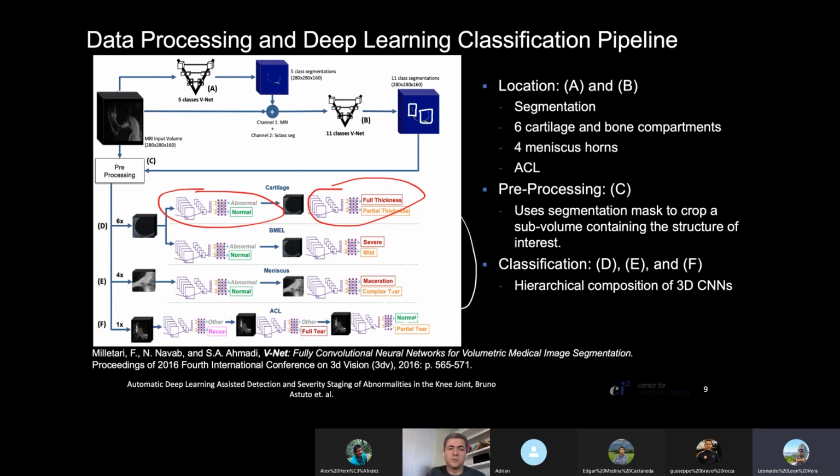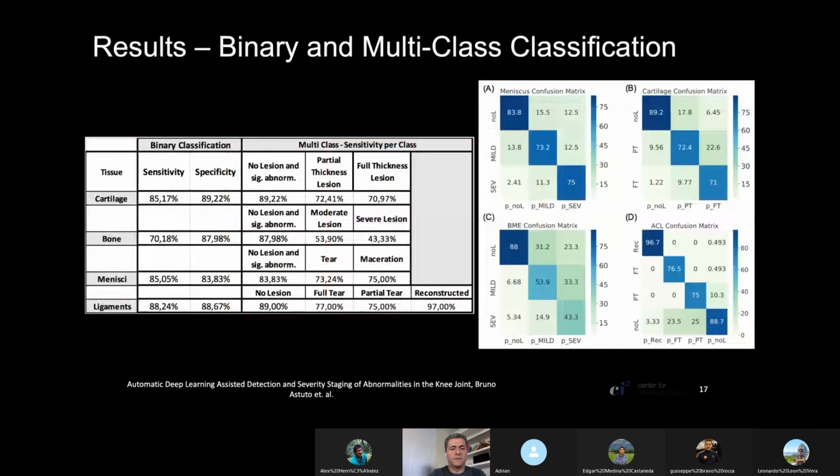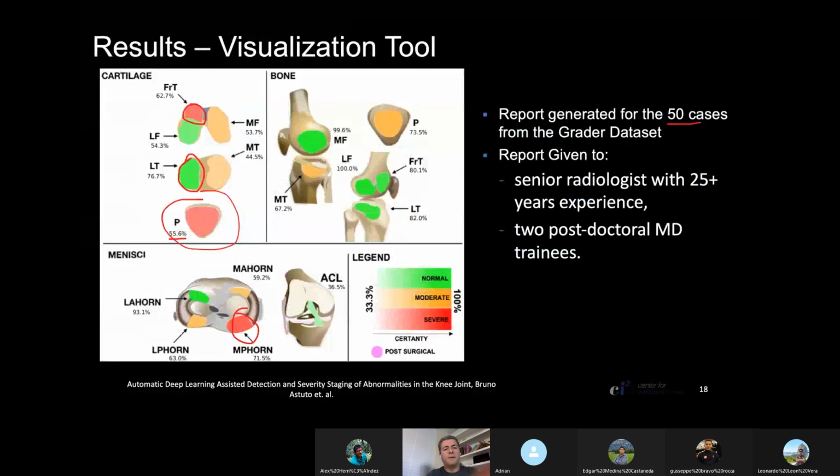That is true. In our pipeline, we have a standalone Python program that has all the models. It reads the CSV that points to the image, loads the DICOM image, does the pre-processing, runs the segmentations, crops everything, and runs all the 17 models, and spits out a table with these numbers and a PDF with this picture here with all the assessments.